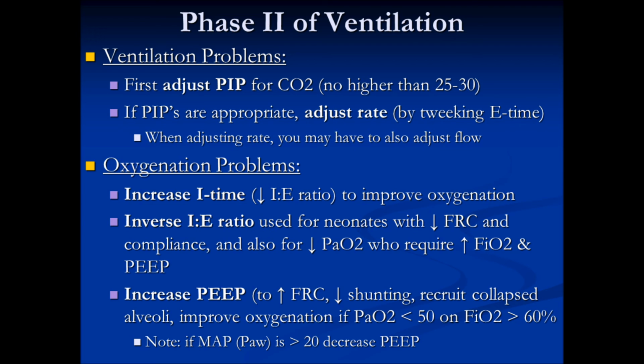Lastly, we consider increasing the PEEP when we have a baby with oxygenation problems, and we don't do it in this order, really. It depends on what is already going on with your baby. I will say the first thing we do consider is increasing the I time, but if the I time is already at an appropriate level, then increasing your I time may not be the consideration.